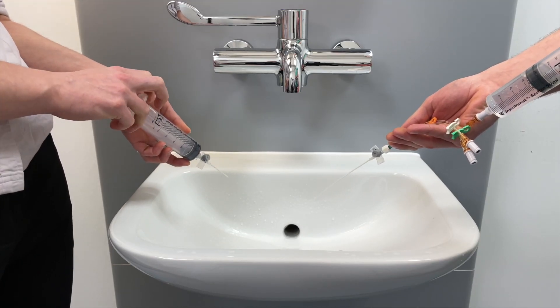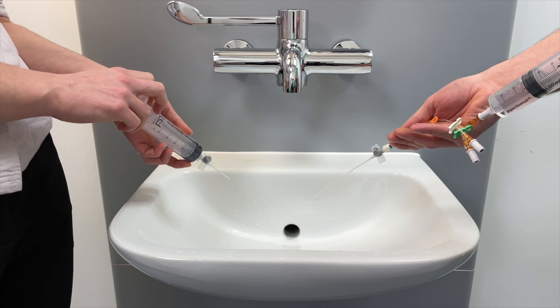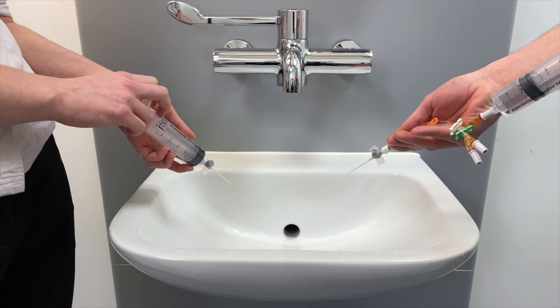In practice this doesn't have a huge amount of relevance on the wards, but if you're trying to resuscitate a patient and get a lot of volume into them quickly, take the octopus devices or bionectars off your cannulas and put your fluid giving sets directly onto the back of the cannula so you've got no restriction to flow. You can also use a special wide bore giving set such as a blood giving set in an emergency.